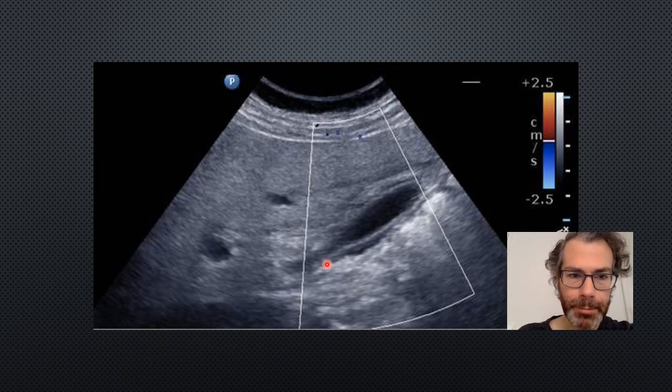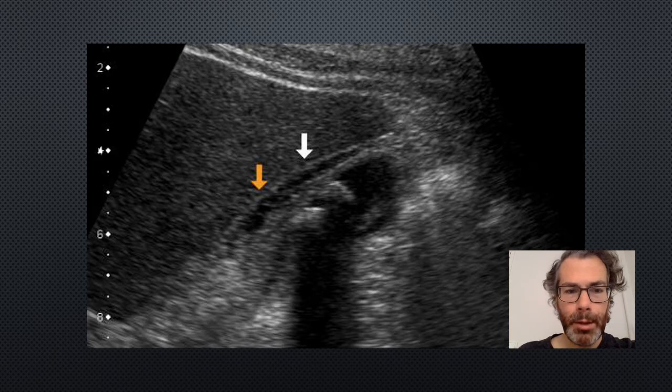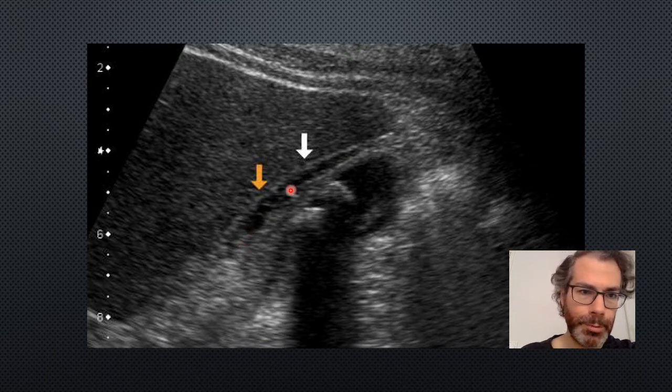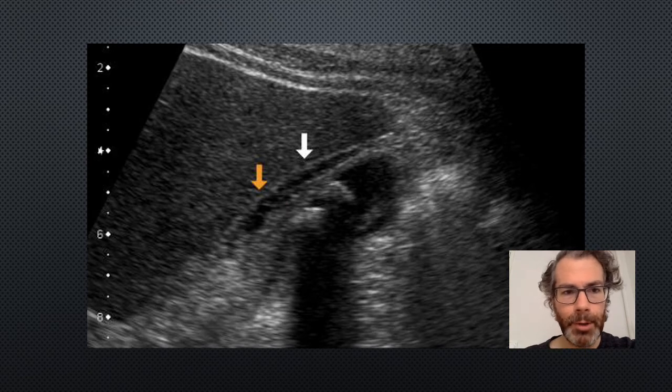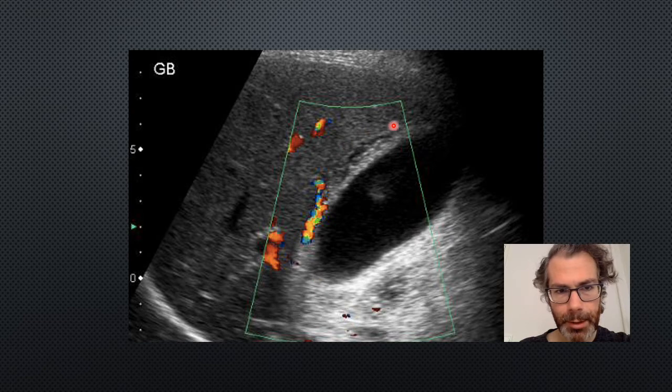Another sick gallbladder. Here you can just see a little strip of pericholecystic fluid just behind the gallbladder there. Another sad gallbladder here with a couple of stones with shadowing, and then a very thickened wall here anteriorly with a strip of either pericholecystic fluid or mucosal edema. Either way, a very unhappy gallbladder. And here's a slightly more subtle example. The wall isn't as thickened here, but there is an area here anteriorly where we can see there is significant thickening of the wall. So it could be an early cholecystitis.